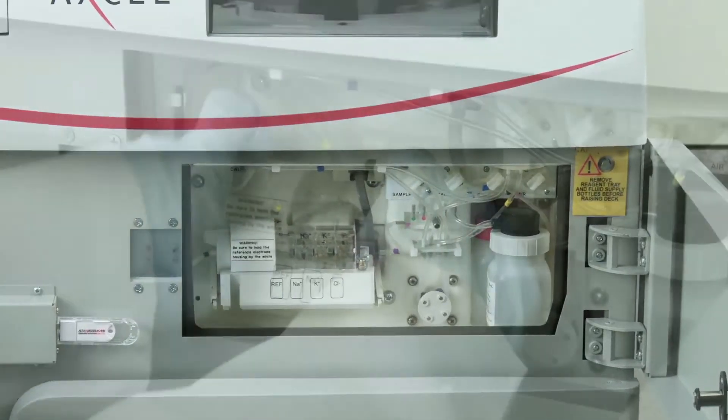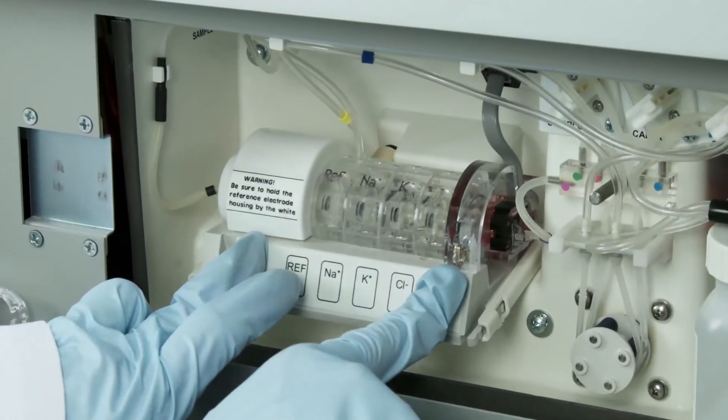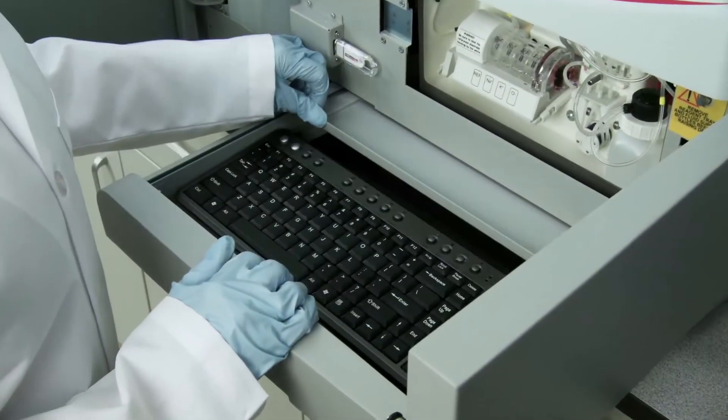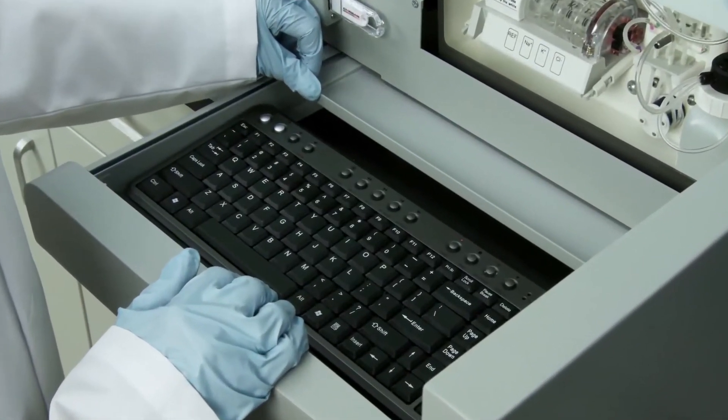Electrolytes are directly measured by ion-selective electrodes that are easily maintained. The wireless keyboard is contained in a drawer below the ISE.